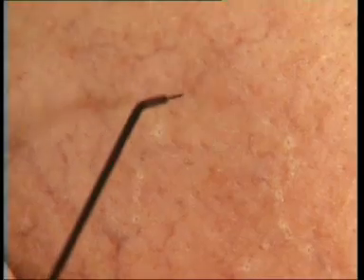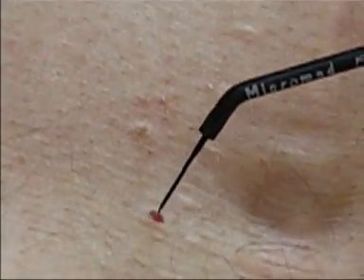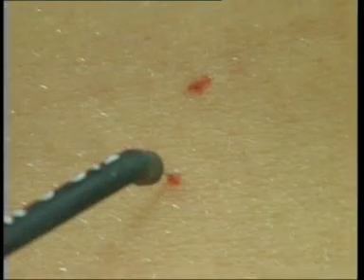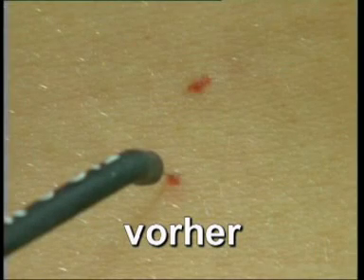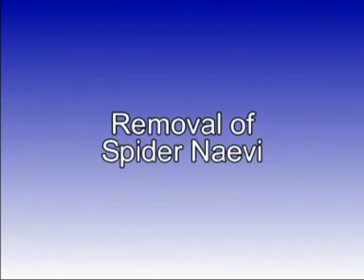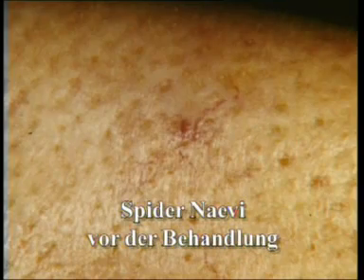The treatment of couperosis is equal to the one of spider bursts, but performed with a more delicate electrode, so that the scab points are clearly smaller. They can be covered with makeup after the scabbing has been completed. Senile hemangioma are removed with just one or a couple of coagulation points. Treating spider naevi, the main influxing vessel is sealed.